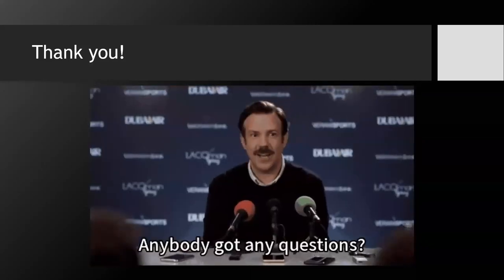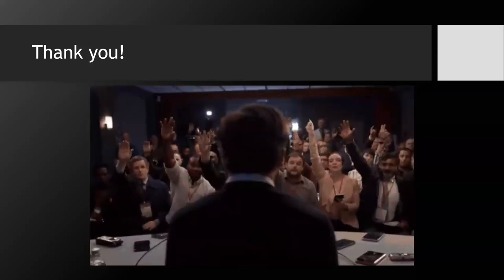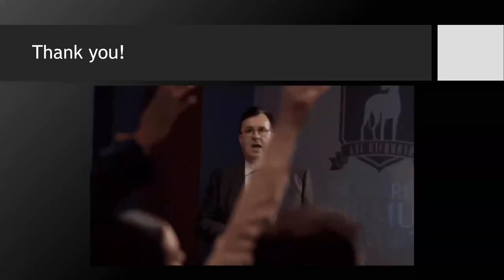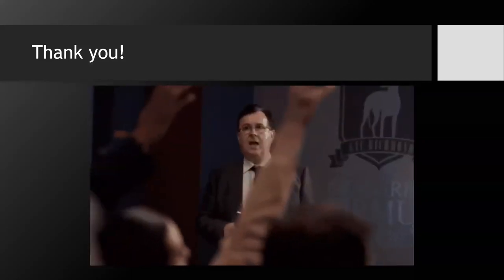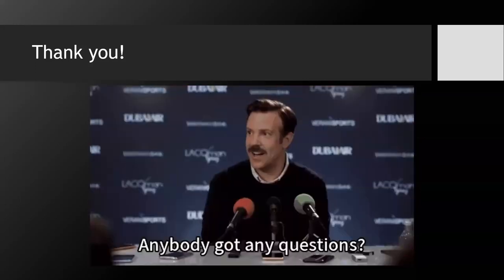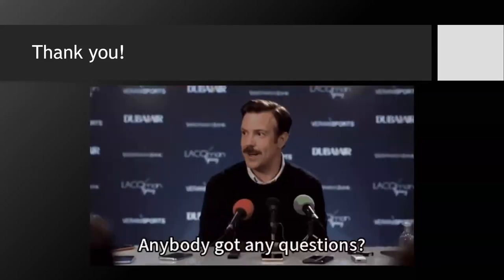Gotcha. And then my last question, sorry, I'm giving all these questions. In an arrhythmia, let's say atrial fibrillation, is there anything you would ever be able to do with the heart rate and the VTI envelope you're calculating, or will it just be inaccurate? Yeah, you average. You take 3 to 5 VTIs. You trace because the assumption is that between those 5 beats, you've sort of gotten the average of what's happening beat to beat. Got it. Thank you so much.